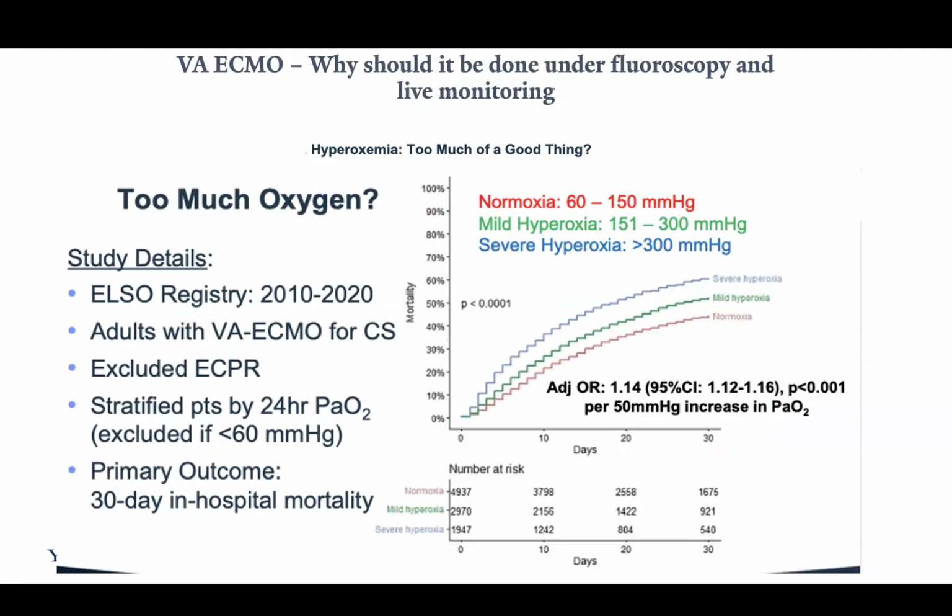So what's your first thing? What's your other access that you should have, Jen? You have A and B, but let's say you finished the cannulation. Your distal perfusion catheter. Okay, that's one. And the other one? An ABG, an A line. From where? Typically from the wrist, right? Which wrist? The right. Why is it the right?